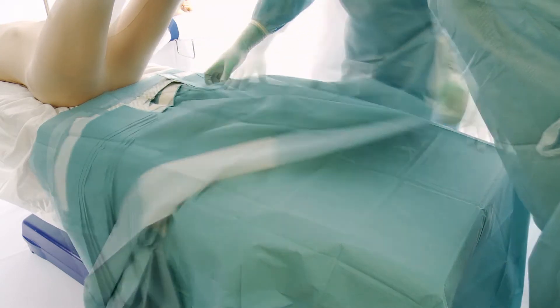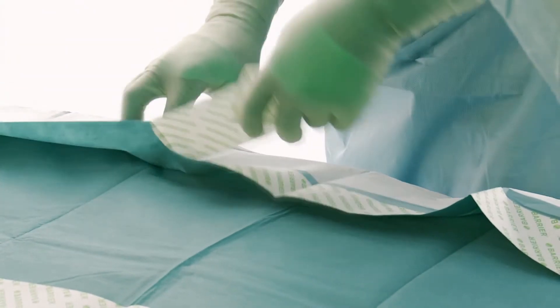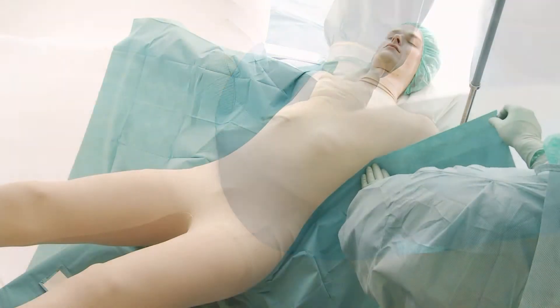Unfold towards the feet. Remove all the release papers. Then apply the split as low as possible on the lateral side of the patient. Repeat on the other side.